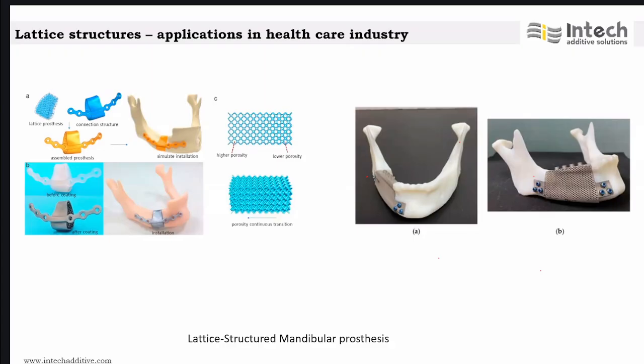You can also see the mandibular before and after installation. This actually highlights how the implant is fixed with screws, and it's been integrated into a surgical model before actually going into the patient. Now you can see different lattice patterns that has been used.